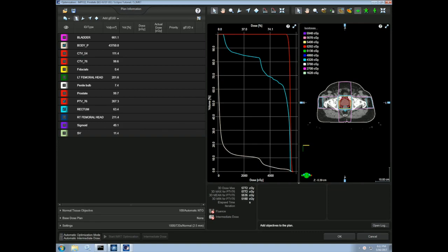Once we have our optimal fluence map, we must then calculate an MLC sequence and then calculate the dose as we previously learned.